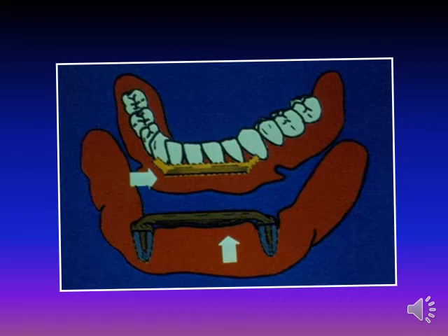Most of the stud attachments are simple in design, consisting of a male stud type that is soldered to the base of the coping, and also the female portion can be soldered to the base in other cases. The base of the coping covers the prepared tooth stump, usually having a post extending into an endodontically treated root canal.